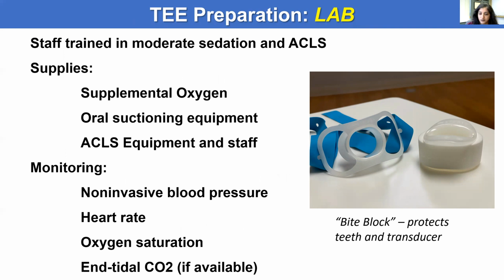sat falls. These are the bite blocks that we use here in Milwaukee to protect both the teeth of the patient and also our transducer.